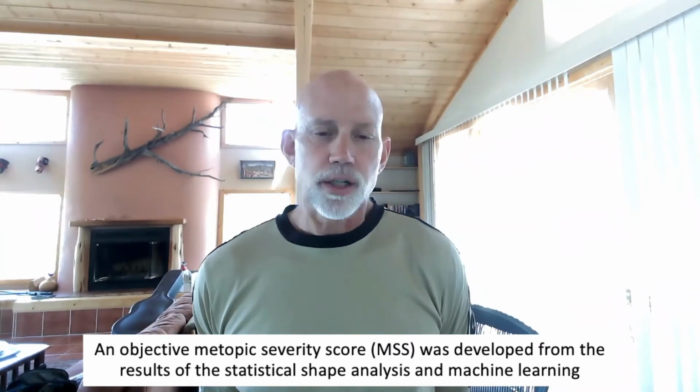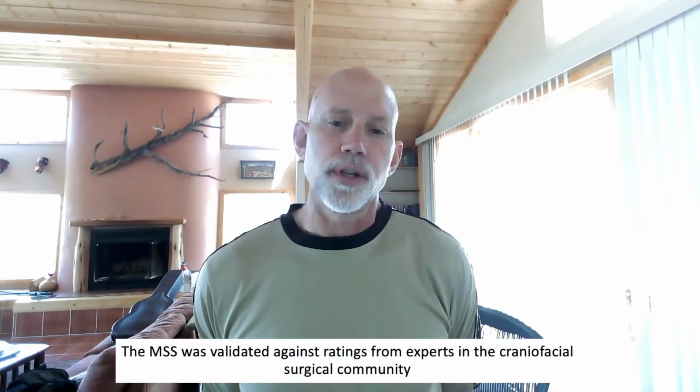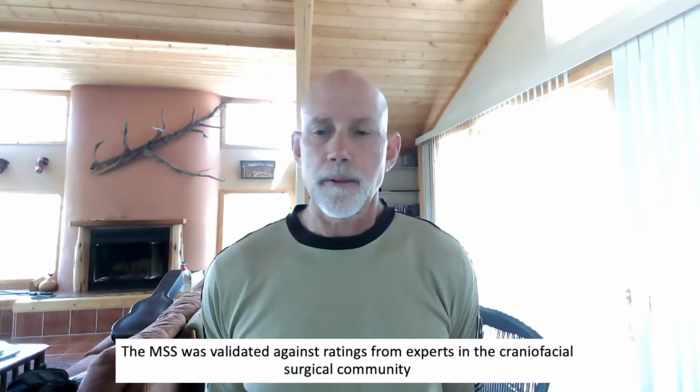Using the results from this statistical analysis and machine learning, we then developed an objective metopic severity score, which was trained to predict the ratings from experts in the craniofacial surgical community. The results of that analysis allow us to process images that clinicians upload into the CranioRate portal and produce quantitative ratings of the severity of metopic craniosynostosis relative to both the normal and patient populations. As our populations of scans grows, we hope to be able to produce progressively richer, more descriptive analyses.